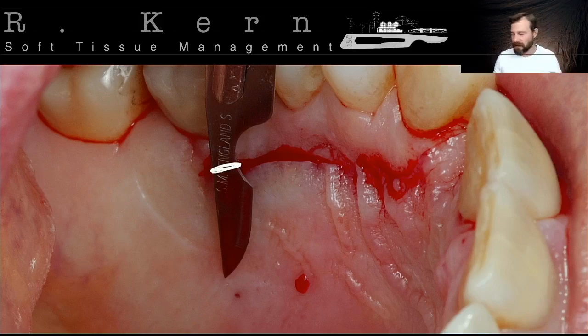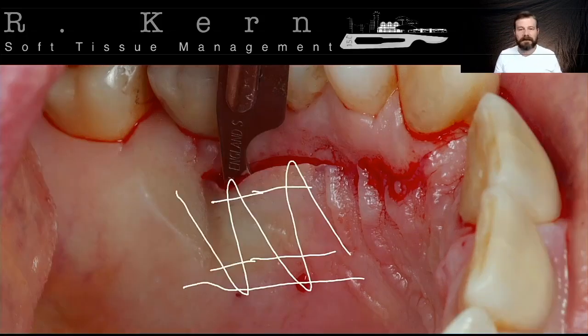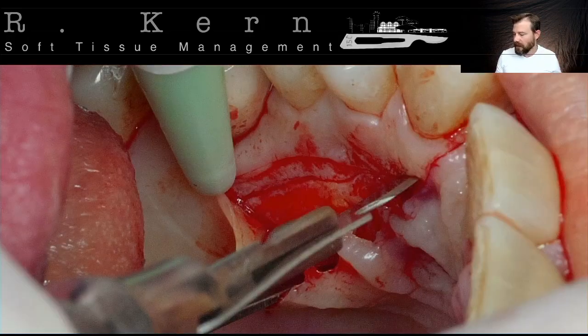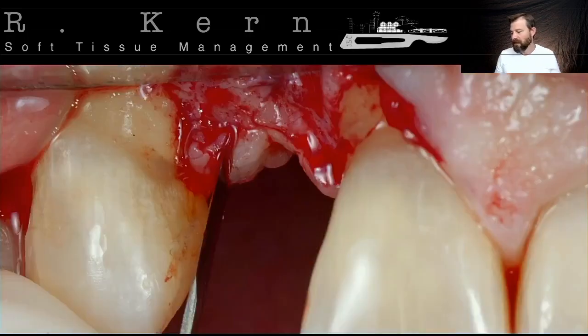If you do not pay attention and you go deeper with your blade neck, you can compromise your surgery by cutting the main palatal blood flow. So this is a small tip for me: always work bringing the blade inside and outside the tissue to see how deep I'm doing the preparation. After raising this window, I'm going to have the access to the pediculum to trim it properly, and we're going to design the pediculum until close to the site, okay?